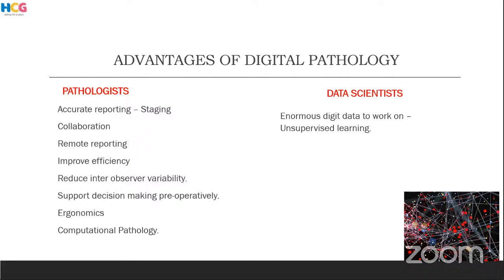And as I said, it provides the platform for the application of computational pathology, which means the application of artificial intelligence and machine learning algorithms in pathology. And for data scientists, there is a huge amount of digital data generated through the pathology images, which can be used as a bridge to work on either radiology or genomics, or act as a tool for developing radiohistogenomics algorithms.